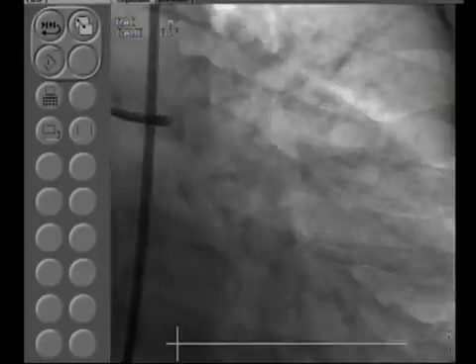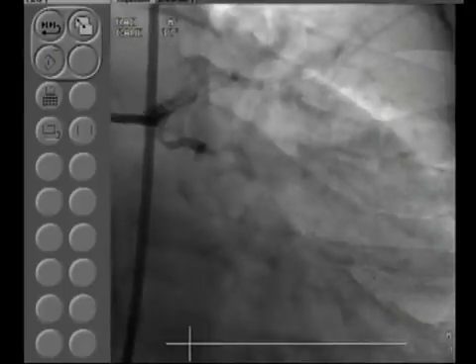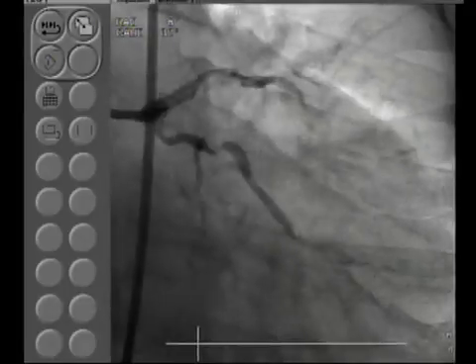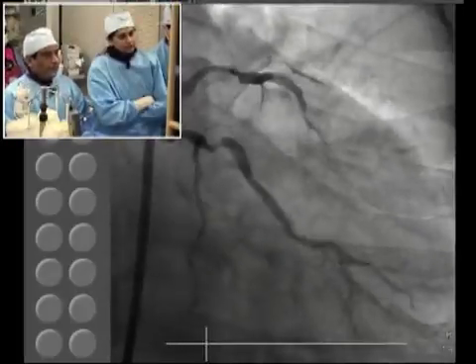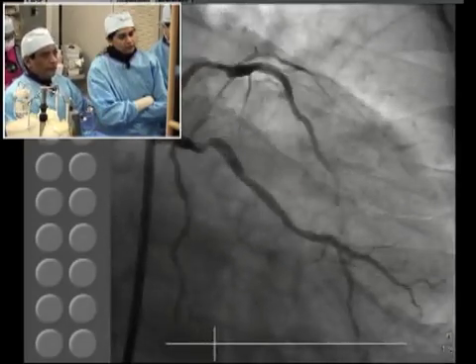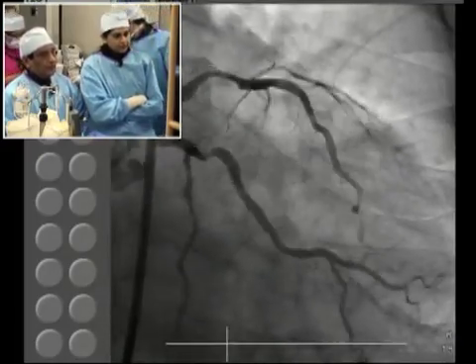All right, Samir, you can see here, maybe you can take over and start before I go on to our slide presentation. In this particular case, as I mentioned in the brief overview, our goal will be to present the case for 3-4 minutes, and then go with the slides for 10 to 12 minutes, and then come back for the performance of the procedure.